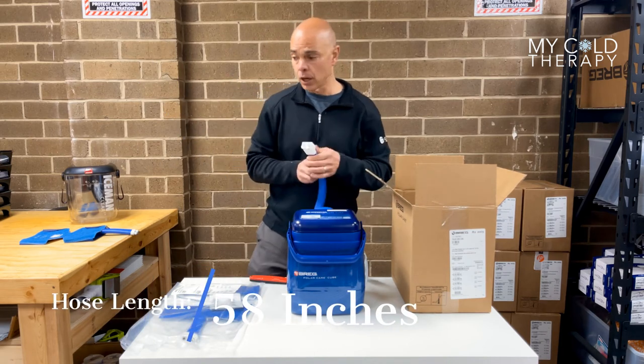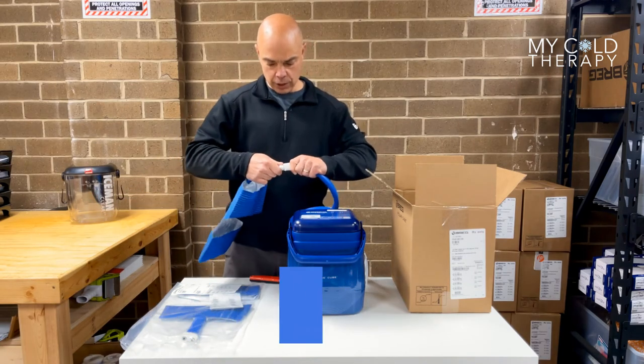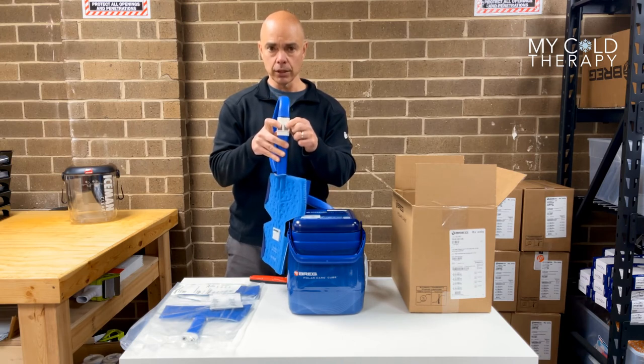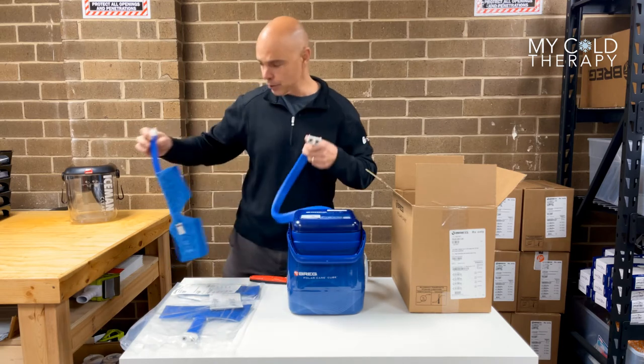This hose is 58 inches long, and when you take the pad, the pad just connects in just like that. There are two connectors on the front, and to undo the pad, just press it down and the pad slides right out.